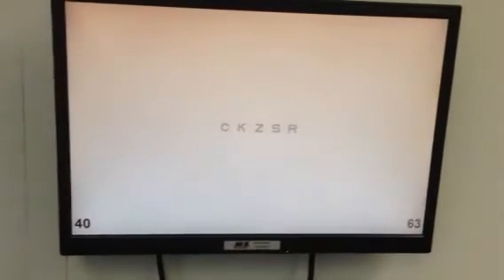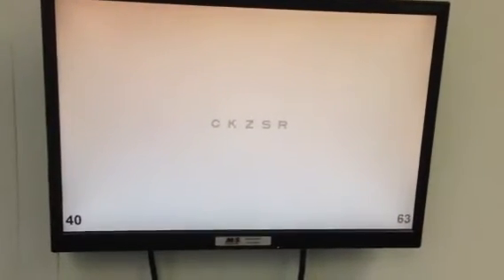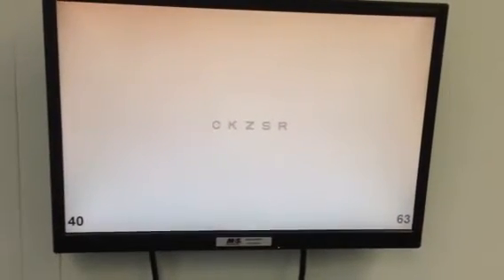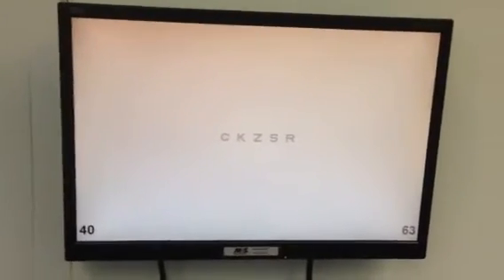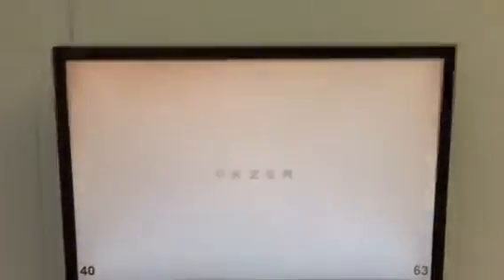And we're going to see then low contrast letters, 2040 letters at 63% contrast. And this one might be easiest for you to control using, you can use the tablet or the remote for this either way. Many of you are used to using the parts of the remote that are the plus and minus on either side that will toggle both contrast and Snellen letter size.